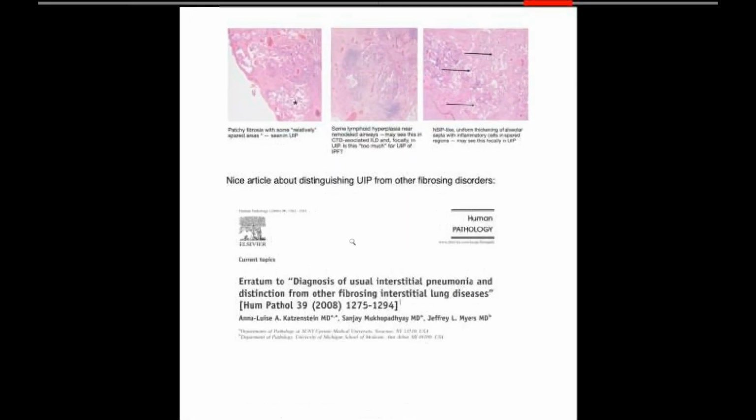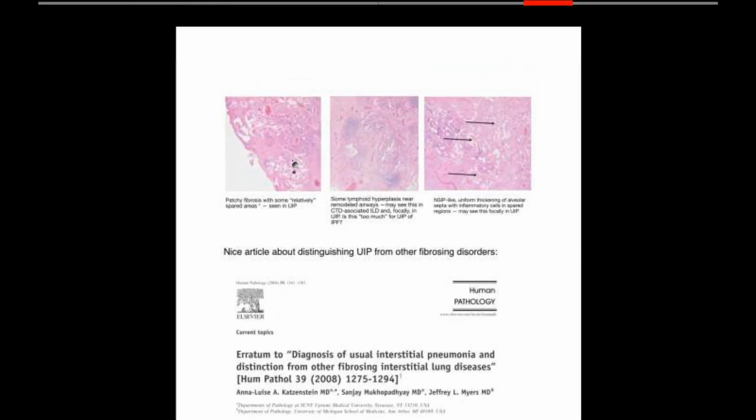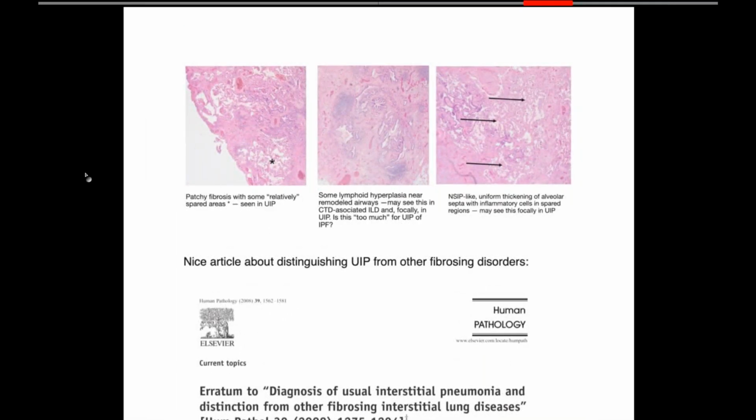the path findings, I'll make this big. So there were findings here, first on the left-hand side, that certainly make a pathologist, sorry about that, think of UIP when there is a spatially very heterogeneous distribution of fibrosis with relatively normal lung in close proximity. And of course, at the boundary between the fibrosis, the pink, and normal lung or cystic spaces, I look for fibroblast foci. And this person, I'm not showing you that, just had very few of them.